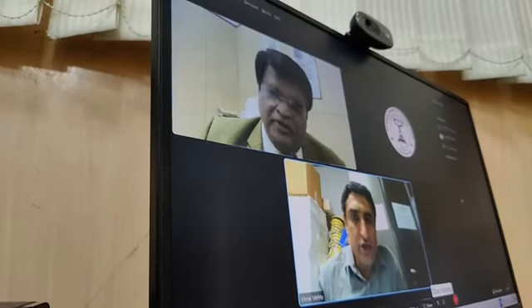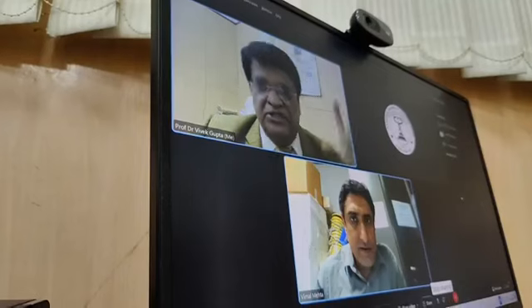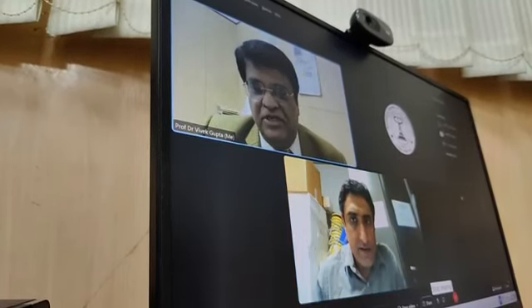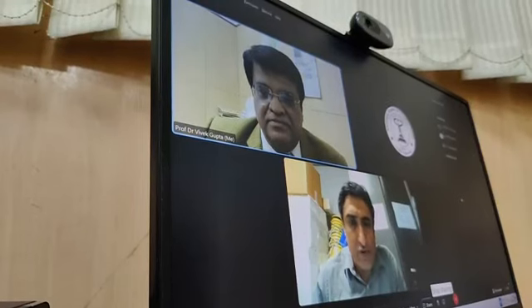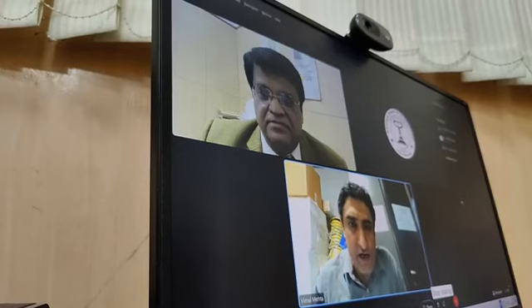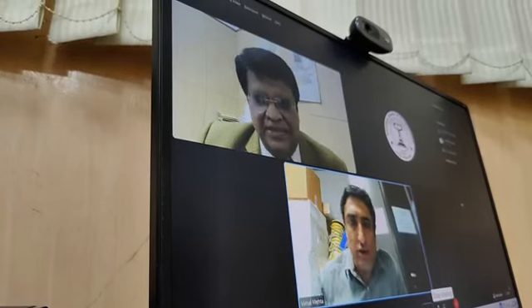It was very important to do angioplasty, and this was not successful. I don't think any other thing can help. Such patients will have to live with this occlusion. I don't know how the RCA was, whether it was collateralizing the left system or not. Sir, no, there was not much collateral, because it was in any case a small, non-dominant vessel.